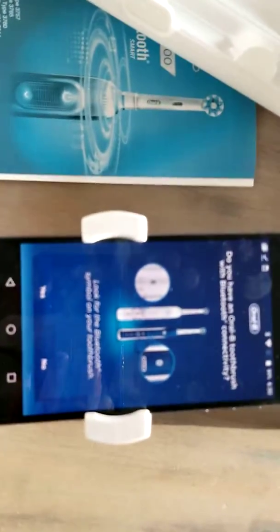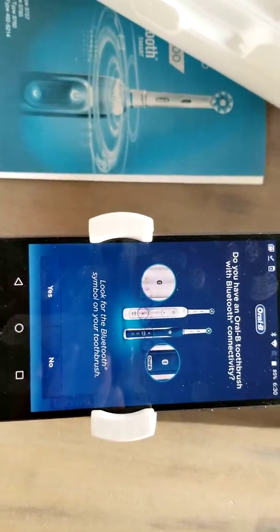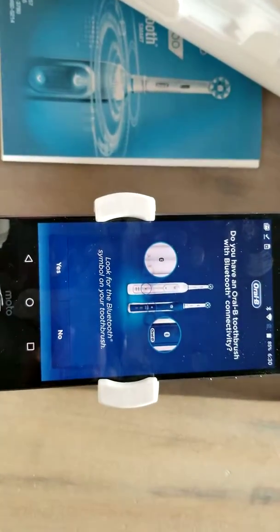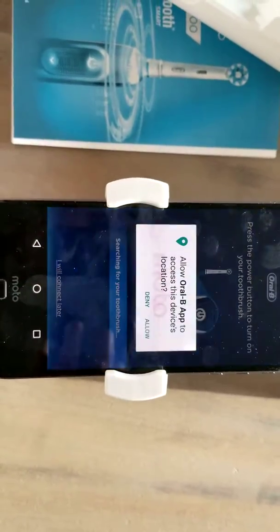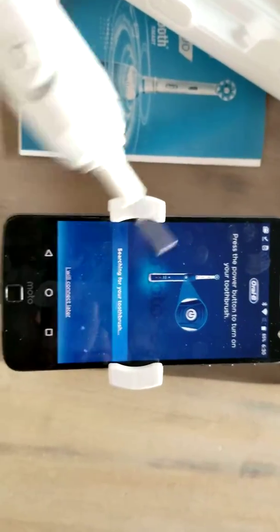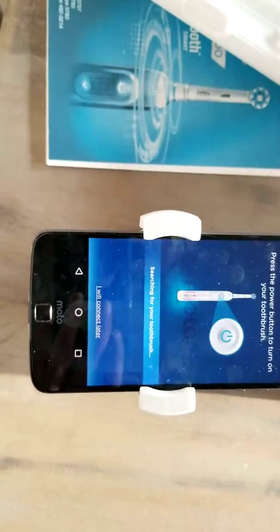Right now it's saying on here, look for the Bluetooth symbol on your toothbrush. Obviously we have that. Do you have it? Yes, so we're going to hit yes. Allow it to access your device. Now I don't really care about location services. It's saying press the power button.